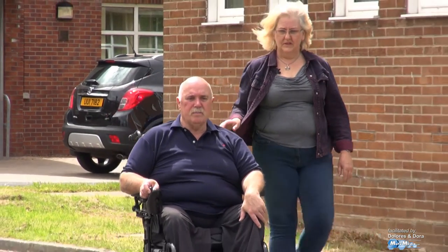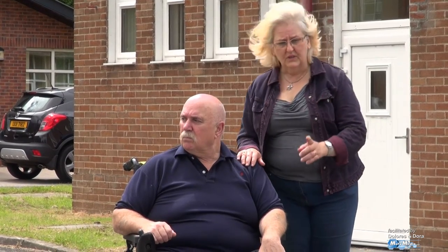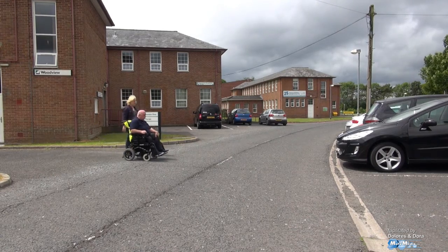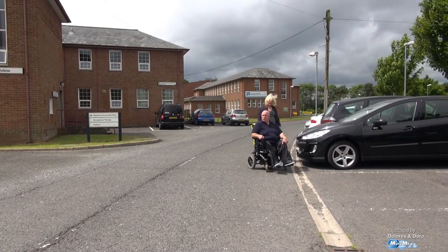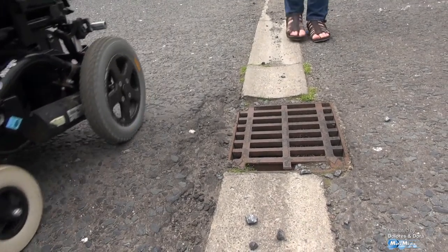Just go to the middle here David, and stop. Now we're going to observe the road. If nothing's coming, you cross directly across, not at a diagonal — straight across, because it's the quickest route to the other side where you will be safe. When we proceed along the road David, make sure you stay out of the channel for the water and any hazards like the drain cover or rough broken bits of tarmac, because otherwise your wheels might catch and place you at risk.